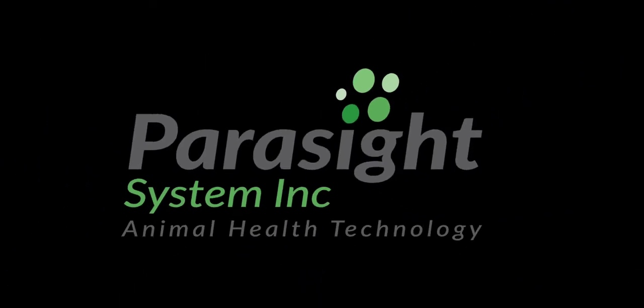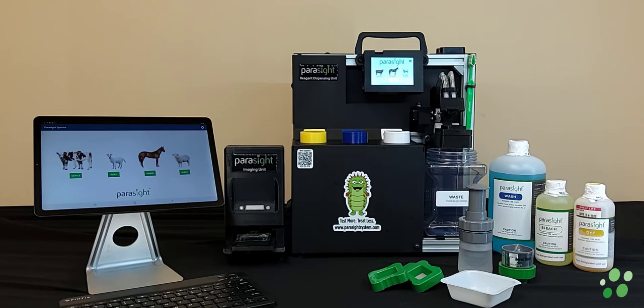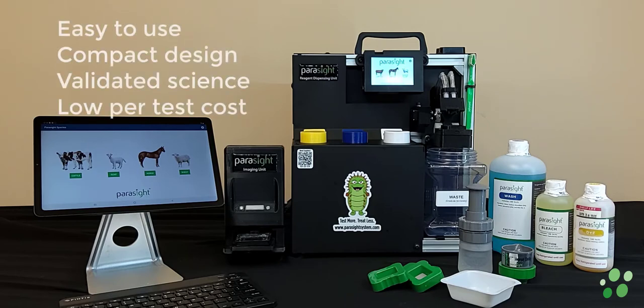Parasight System Animal Health Technology introduces instant digital parasitology for today's veterinarian. Parasight System provides you an easy-to-use interface, compact footprint, and validated science to perform push-button fecals for horses, cattle, sheep, goats, and soon dogs and cats.